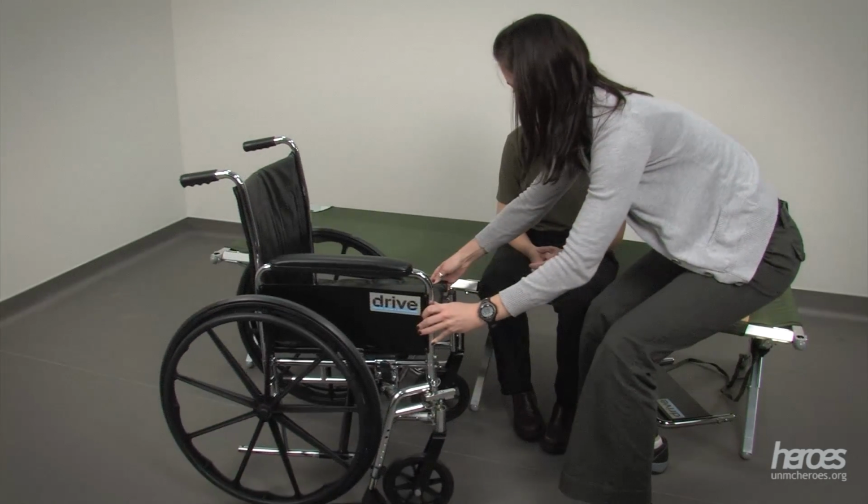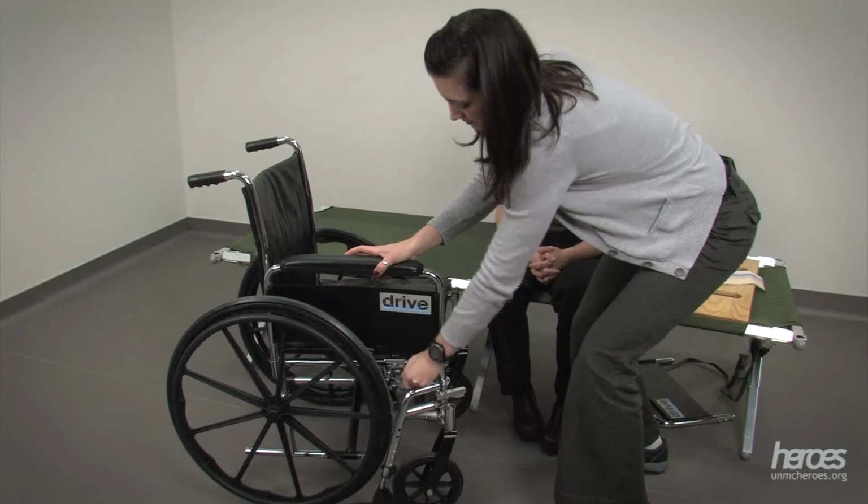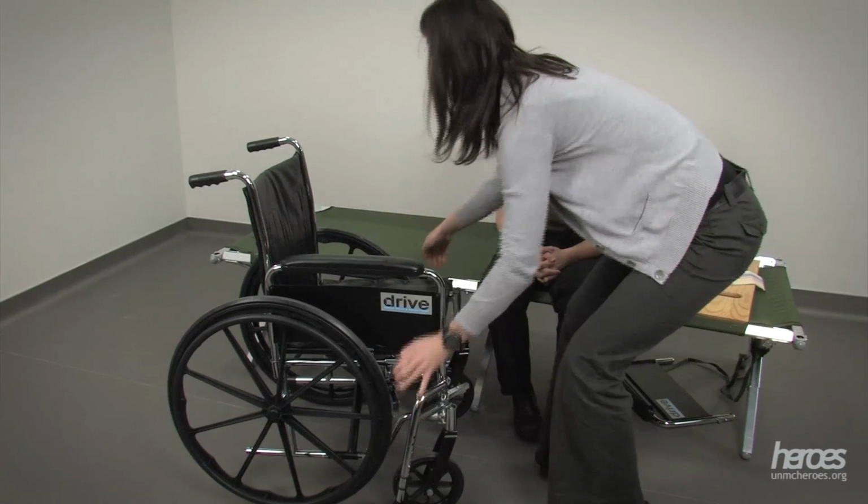Reposition the wheelchair closer to the individual and at a slight angle to the cot. Once the wheelchair is repositioned, lock the brakes on both sides.